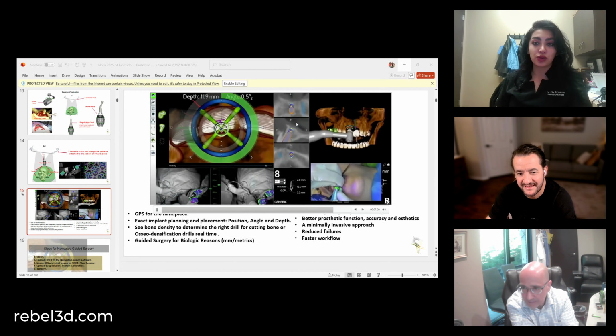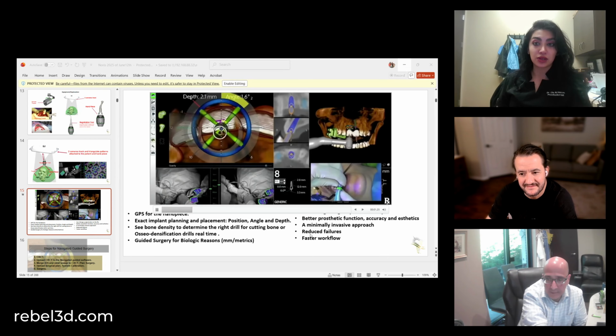It's also fascinating in cases where you're doing crestal sinus lifts, right, Dr. Iskandar? Yes. For example, if you're drilling and you're getting to the sinus floor, you can actually see, just like you did here with the nasal floor, where the sinus floor is and where you need to stop, and that's when you start condensing and packing in your bone grafting material. And then you can start oversizing, undersizing your drill until you get to the desired size. So many different advantages, whether it's in hard or in soft bone.